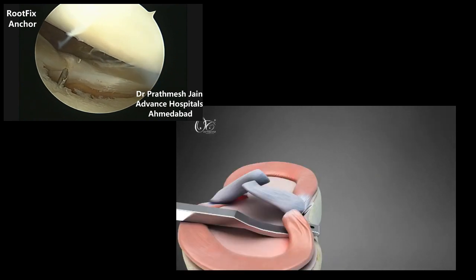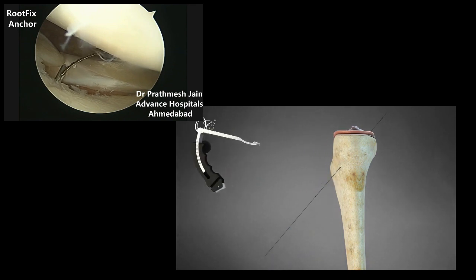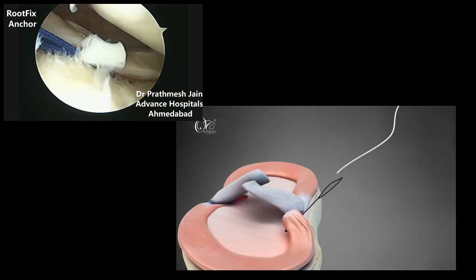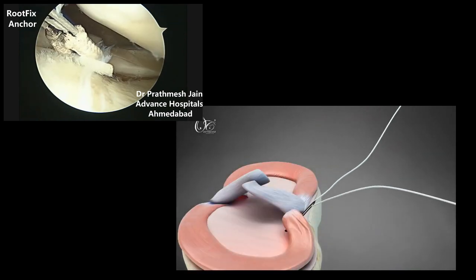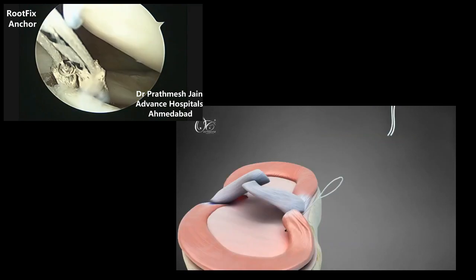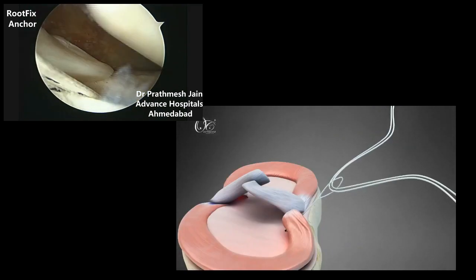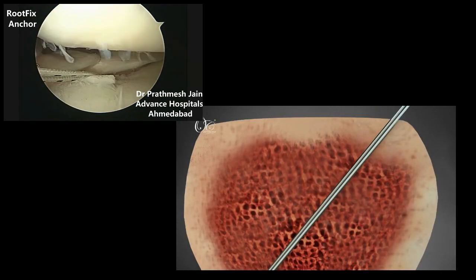The cannulated sleeve is placed for the OsteoCare crosswire. Pass the loop and fiber through suture shuttle devices. Then pass the introducer fiber through the tibial tunnel, and withdraw it from the accessory medial portal with the help of a loop and fiber.